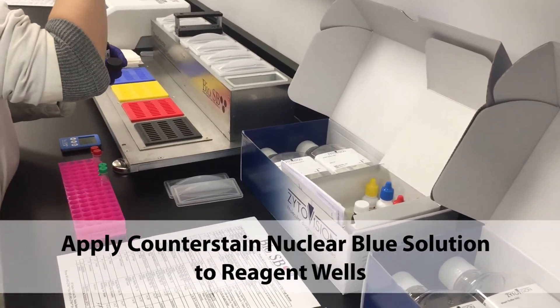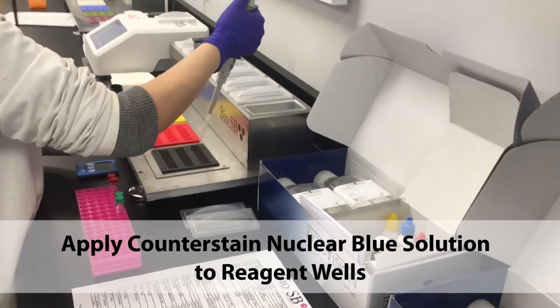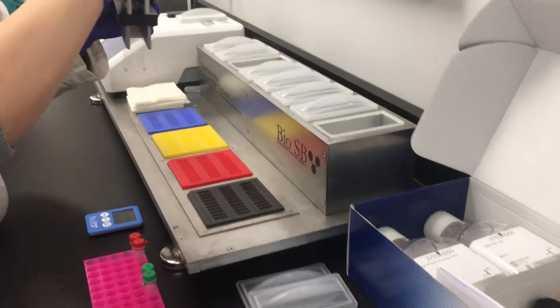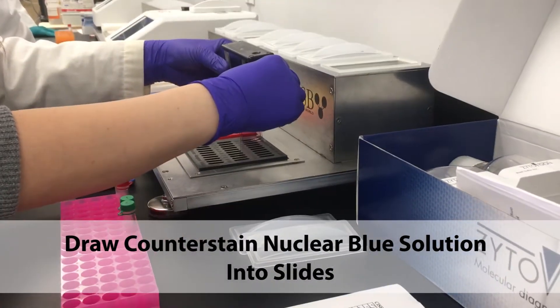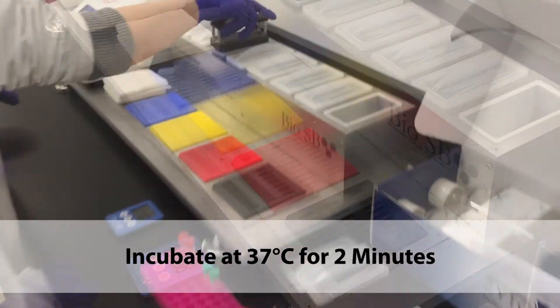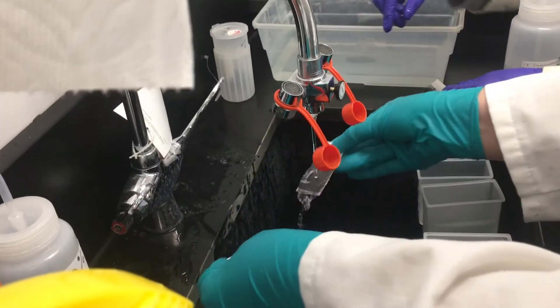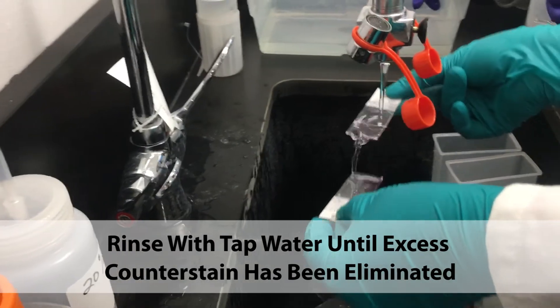Apply the Counterstain Nuclear Blue solution to the reagent wells. Draw the counterstain into the slides and incubate at 37 degrees for 2 minutes. After incubation, rinse with tap water, making sure the excess counterstain has been eliminated.